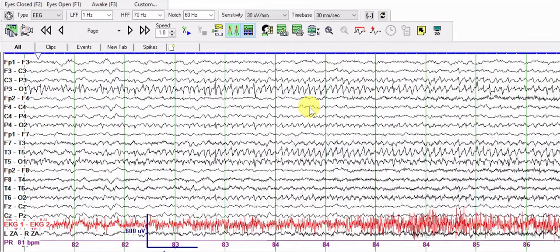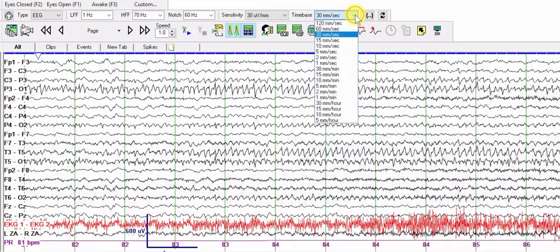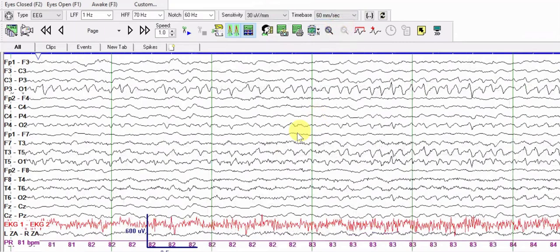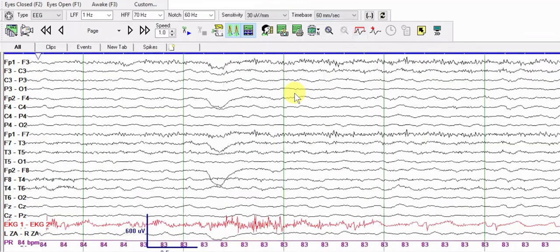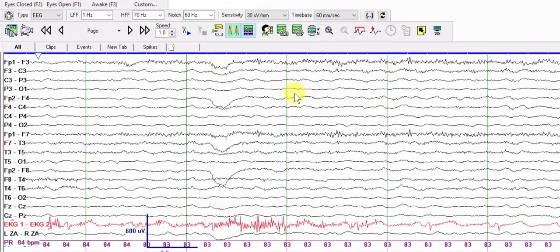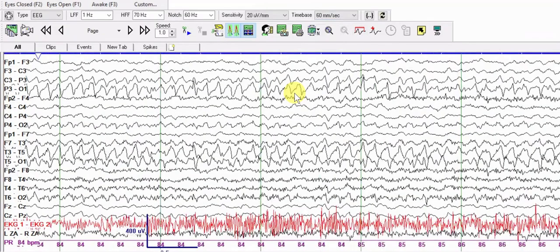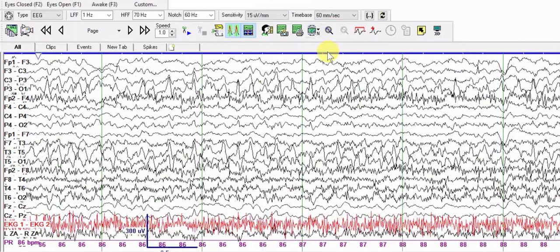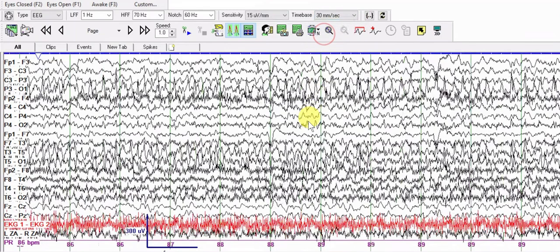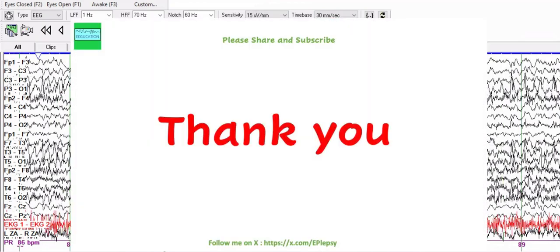The key message from this tutorial is to play with the different controls and parameters. Change the gain — normally in adult patients we use 7 microvolts per millimeter, but try 10, 20, and 30 as well. You can also change the time base from 30 to 60 millimeters per second to spread out the EEG, which gives a better appreciation of seizure activity. Normally we use 30 millimeters per second. I hope you've learned something from this tutorial — hope to see you at the next one, thank you.